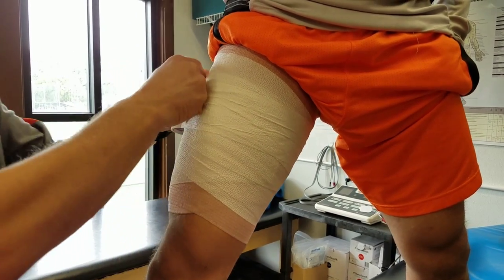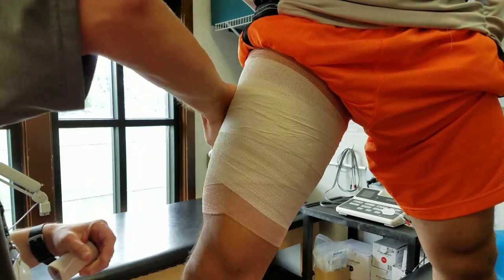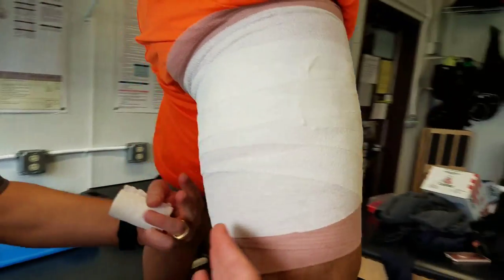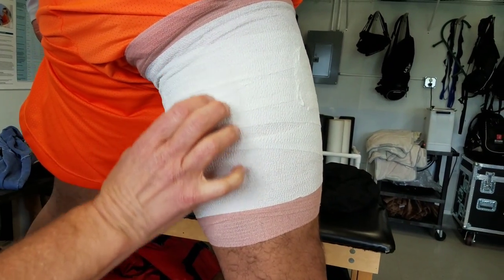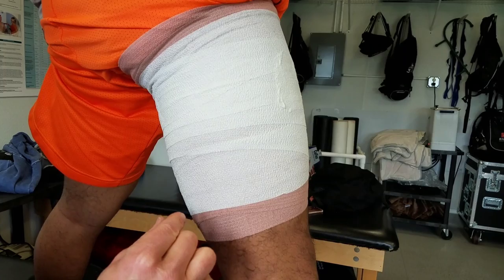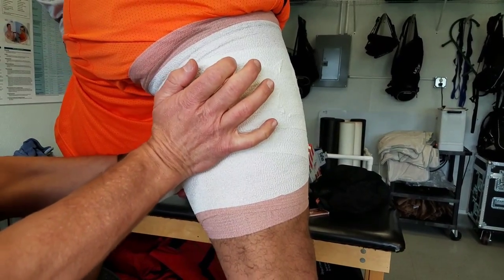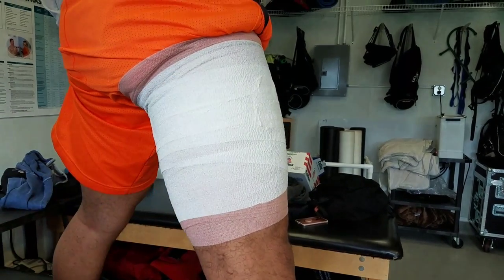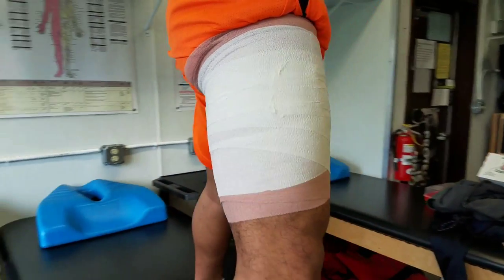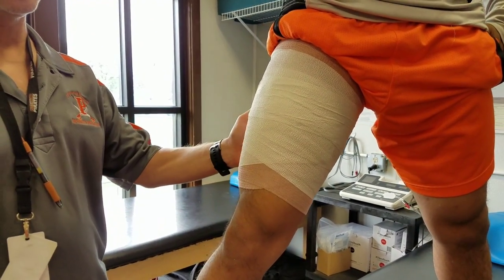Since I have a little tape left, I'll go ahead and tear that off and secure it down. You can use that same principle on the back side if you're trying to address the hamstring. Some people also use a foam pad — a quarter- to half-inch piece — especially over the area where it's sore, to use as a compression device on the strained muscle area. Those are also options, but that gives you an idea of a basic thigh wrap for quadriceps or hamstring.